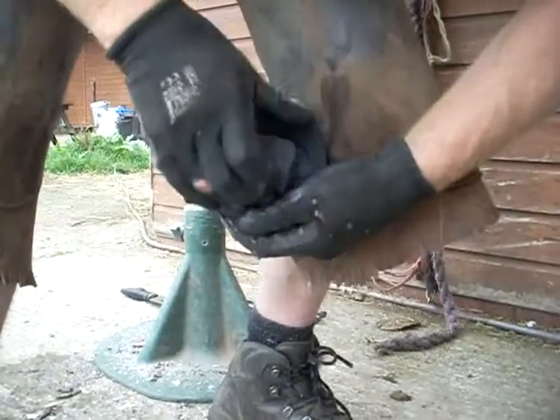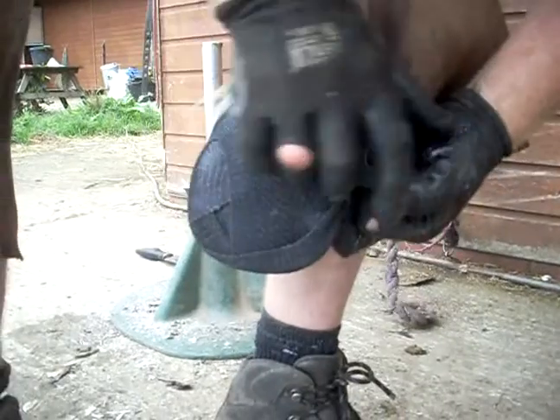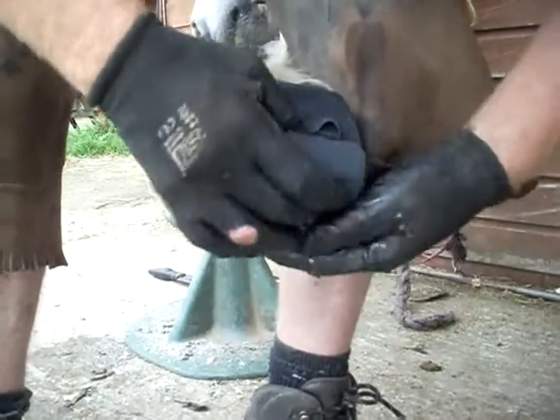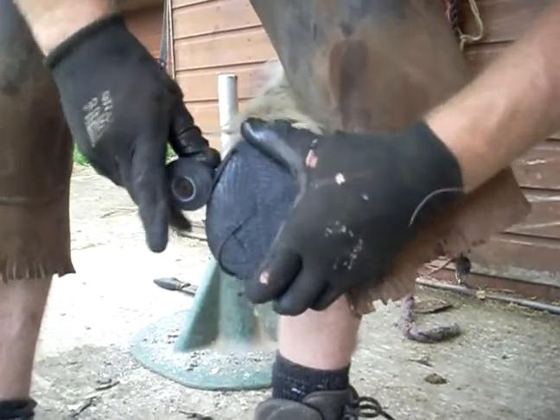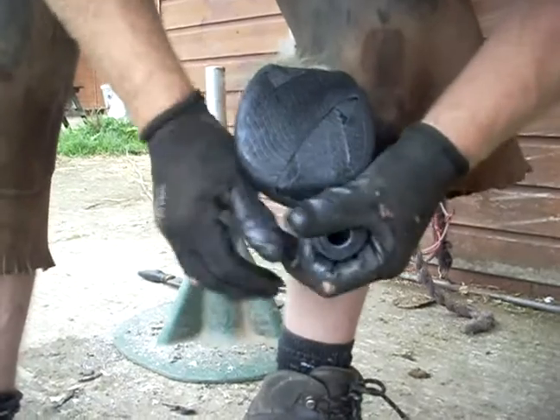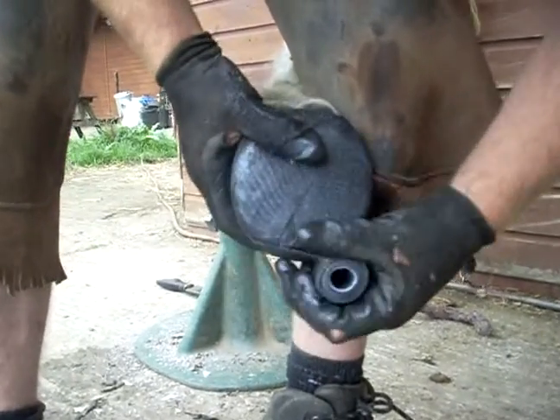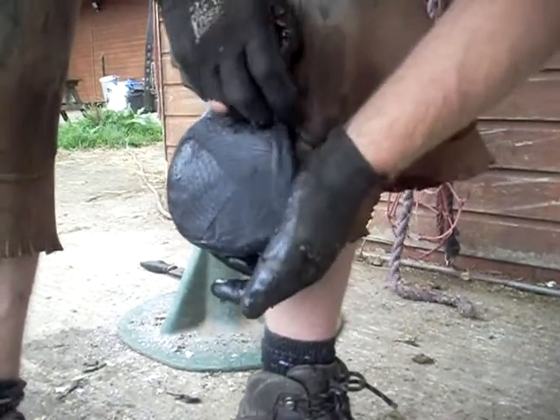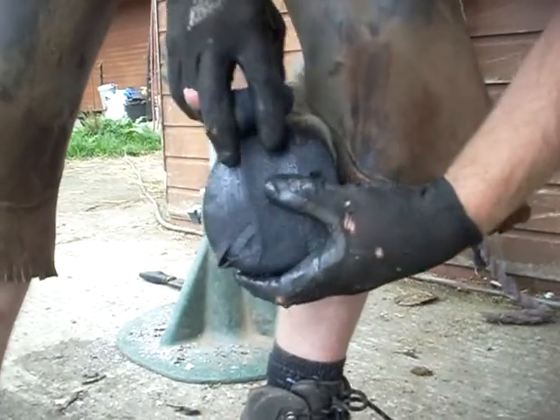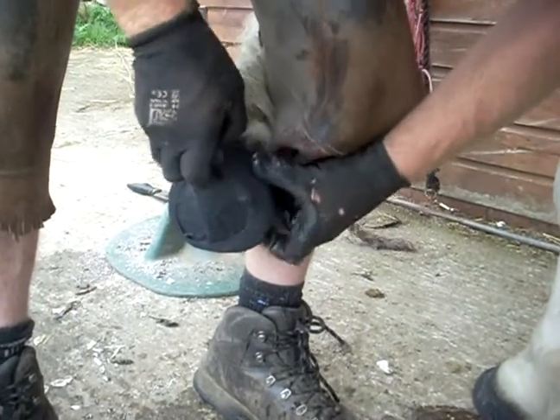You've got to work relatively quickly because it only takes — depending on the outside temperature, today's about 19 Celsius, so it's a relatively warm day — it will start to cure in about a minute from now. If I don't get it on fairly quickly, the roll will go hard and I won't be able to use it. So it's important to make sure you've got everything prepared before you open the pouch and put the water in. Make sure you've got your gloves on already and the foot is exactly ready for the application, because if you start messing about once you've opened the pouch, the hoof cast will set and become unusable.